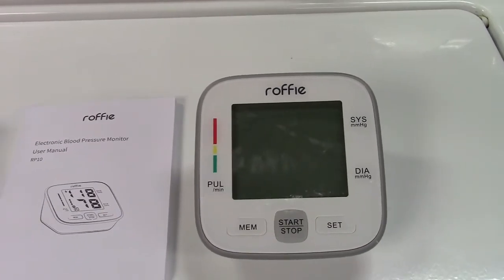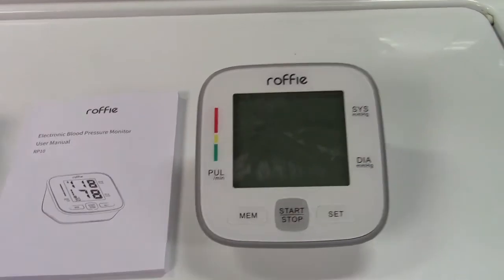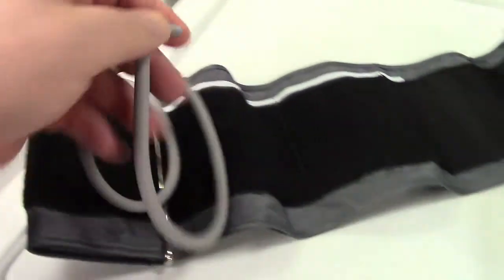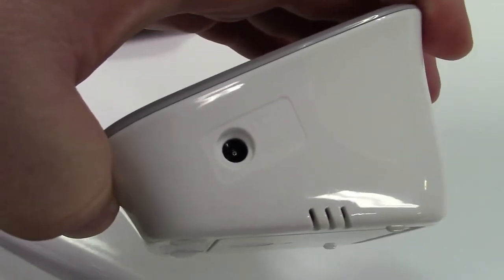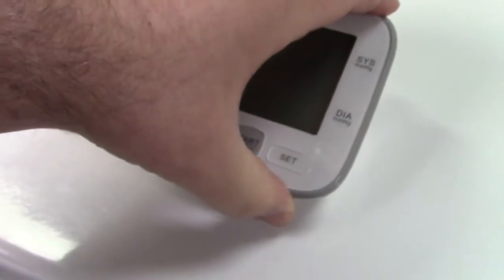It runs on four AAA batteries, so I'm going to put those in and give this a test. Here is the arm cuff — it has a tube that plugs into the side of the unit. On the other side there's a jack for a six-volt power supply, center positive, if you prefer not to use batteries.